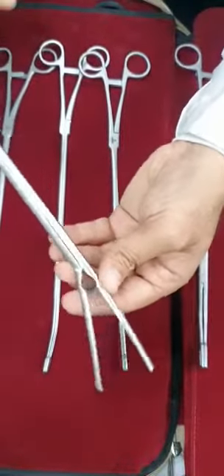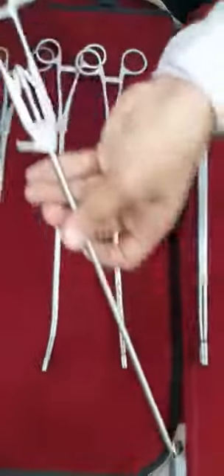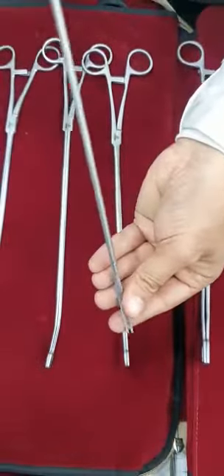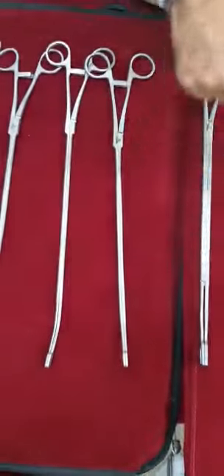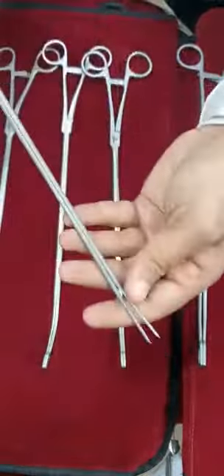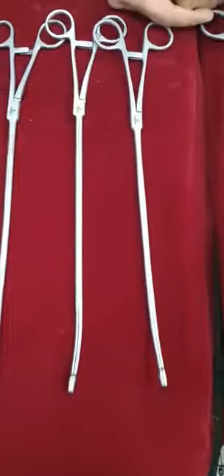Then we are having this Chitwood or DeBakey type of holding forcep. We have designed needle holders, a 5 mm knot pusher just to push the knots, then Metzenbaum scissors — 5 mm Metzenbaum scissors — and 16 inch DeBakey forceps. We can customize things as per your needs in VATS surgeries. We have an entire range of VATS instruments; these are just a few instruments I wanted to show you today. Thank you very much, I really appreciate your time.